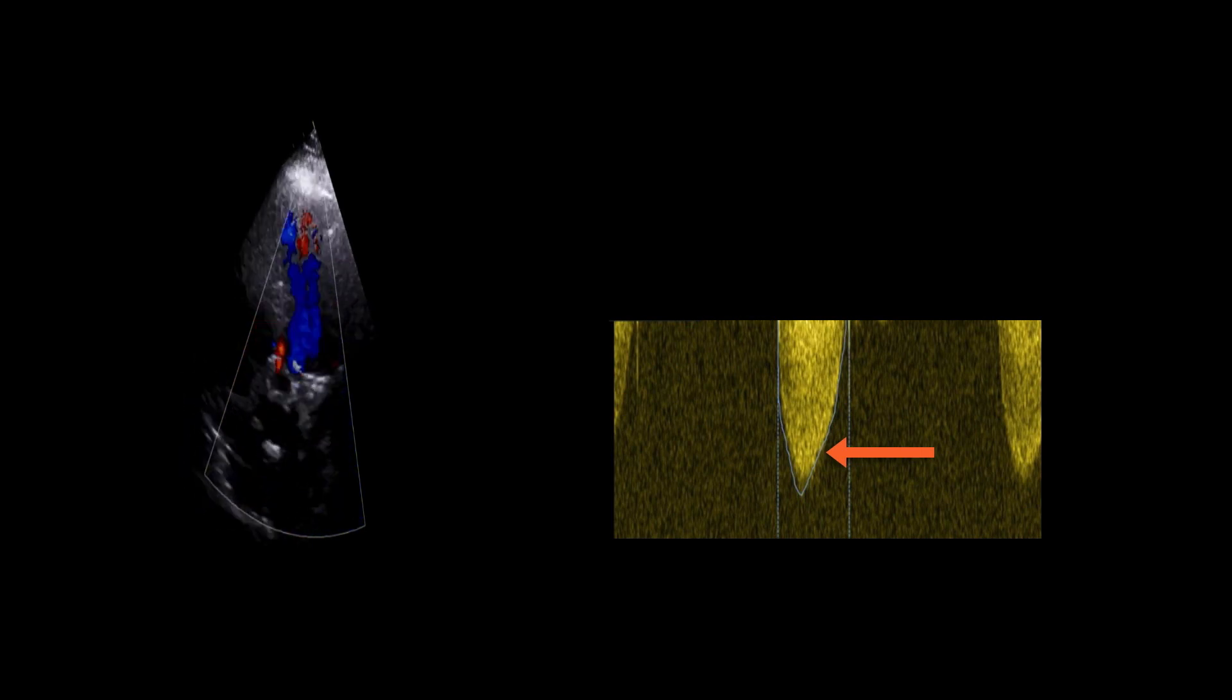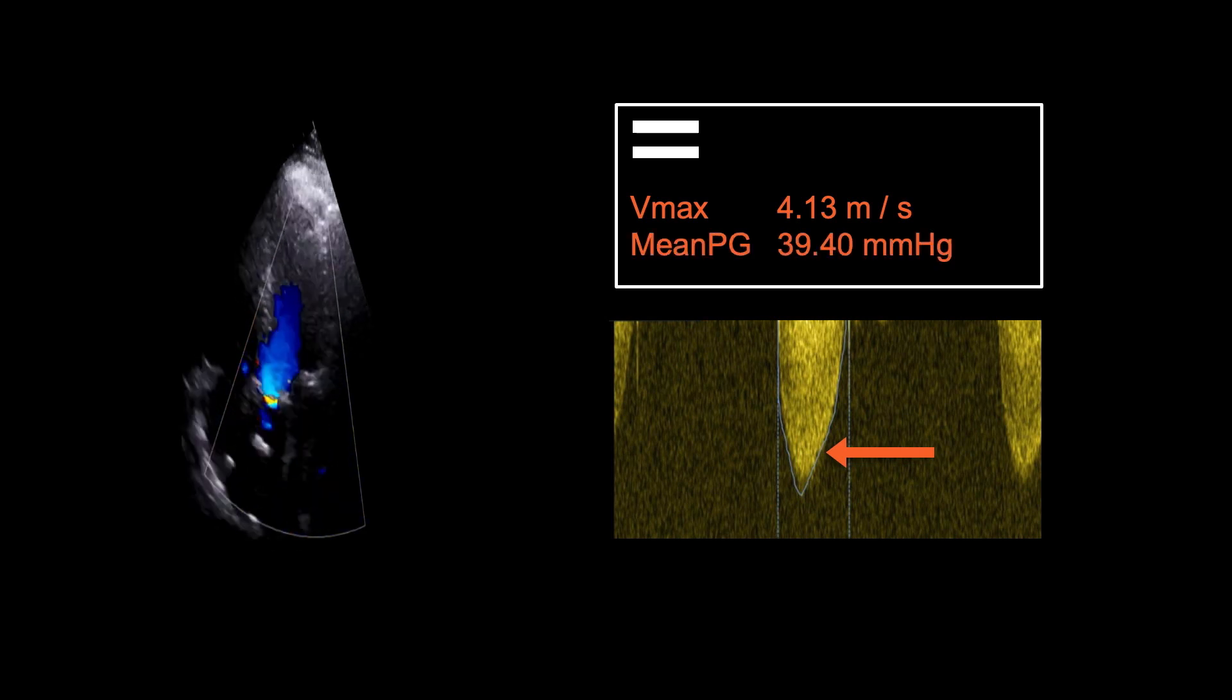Again, we trace the Doppler profile to assess the flow and pressure gradients across the valve. For this patient, the peak velocity is 4.13 m per second, with a mean pressure gradient of 39.4 mmHg.